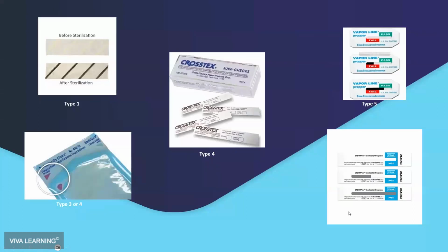Lots of different manufacturers of these types of integrating indicators. This is what goes in every load of instruments being sterilized. You don't need to save them. I get questions about that all the time, wanting to know if they have to save them, if they have to document them. All you really need to do is make sure that you are documenting, unless you're in Canada because you have other requirements to do, but in the US, that you're documenting as part of your protocol that you run one in every load. So we've got a couple questions I want to answer before we move on.